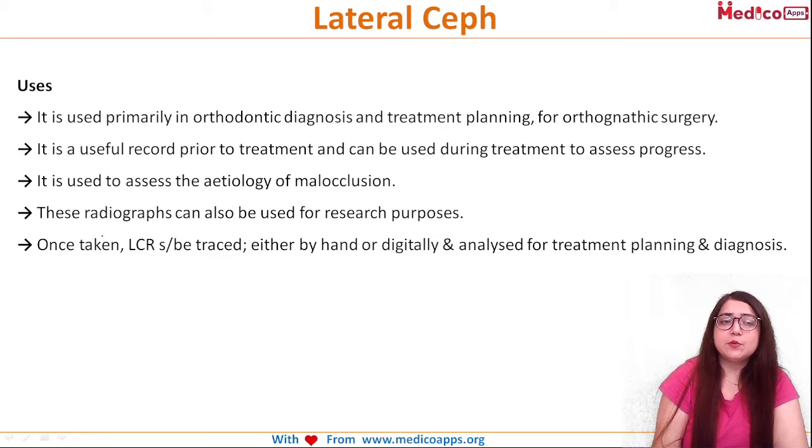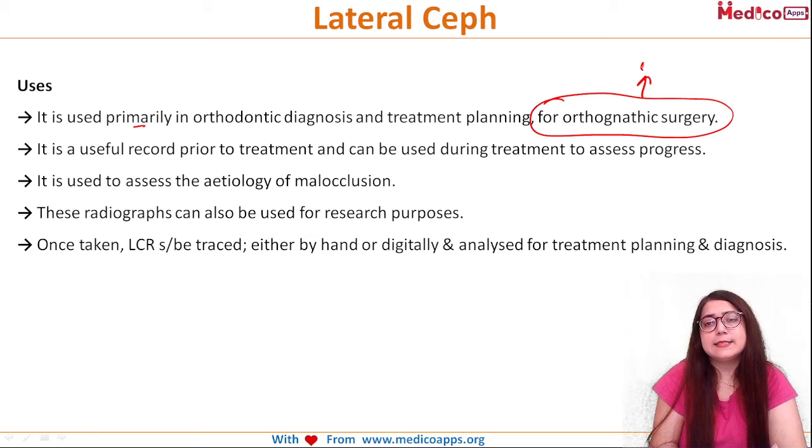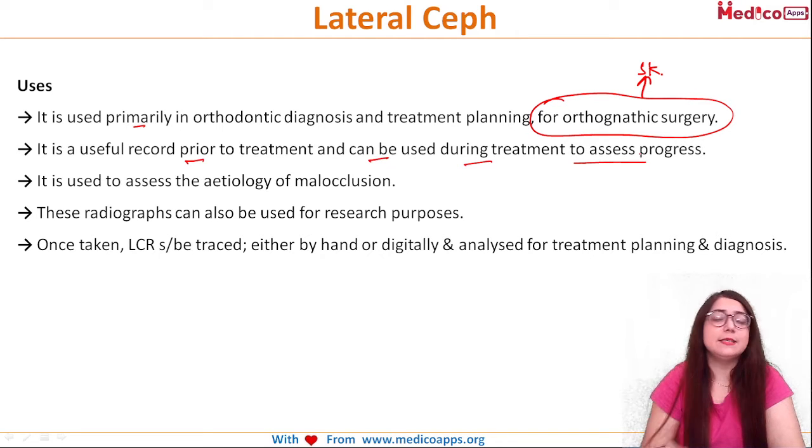Now what are the uses? First and foremost, it is used primarily in ortho diagnosis and treatment planning, especially if the doctor is planning orthognathic surgeries in skeletal malocclusions, right? It is useful to record the lateral ceph and OPG prior to the treatment, and they can be used during the treatment to assess the progress.